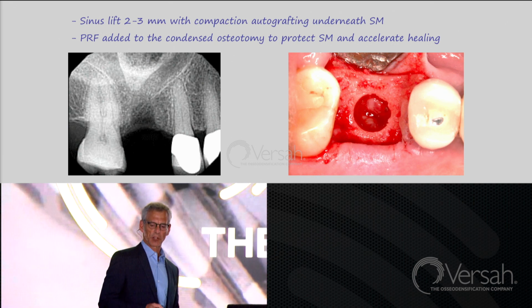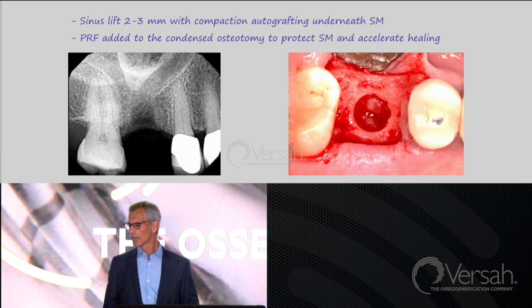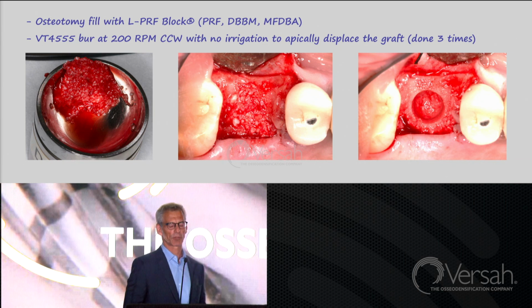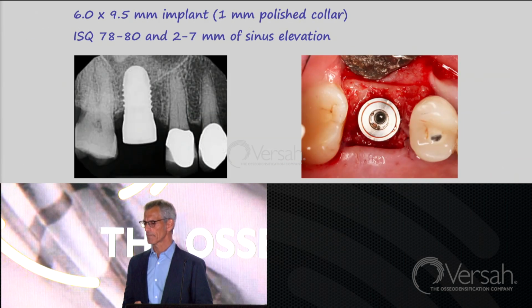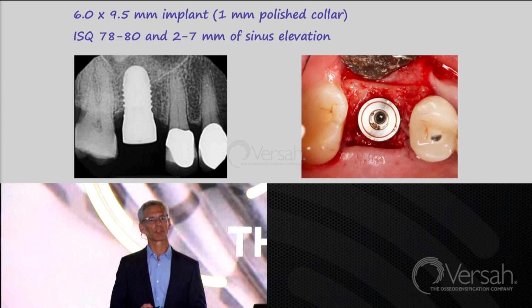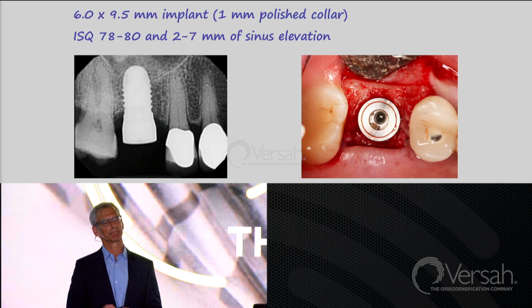radiograph to show how I have decorticated the floor, graft PRF, my PRF block in counterclockwise rotation, and a subsequent lift of 2 to 7 millimeters with an incredibly high ISQ reading on a 6 millimeter diameter implant.